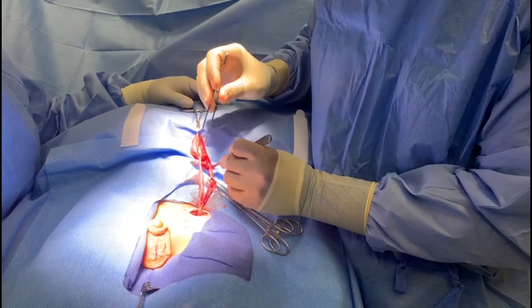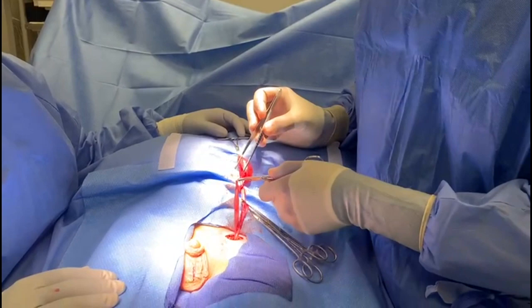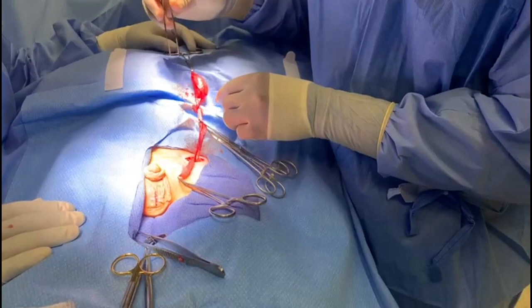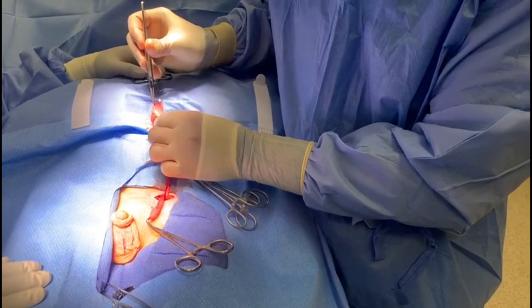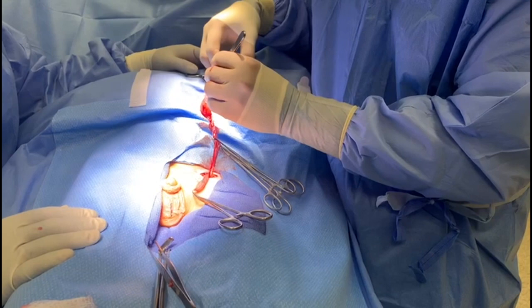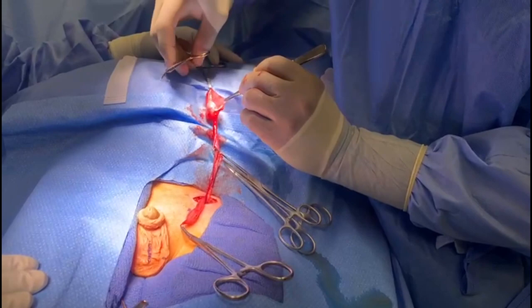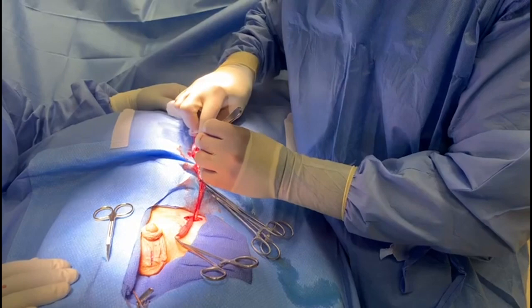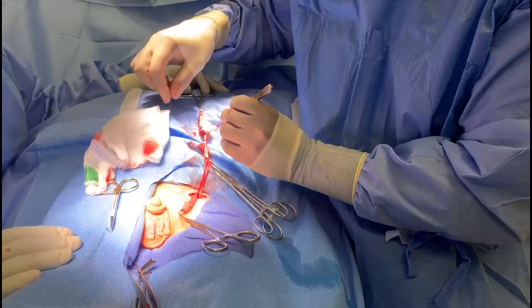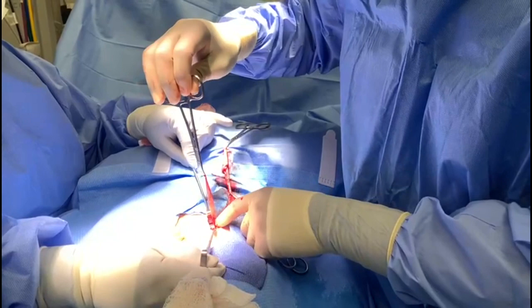We're going to open up the hydrocele and then fix the hernia by taking it down. We've disconnected the hernia — we'll take this all the way down to the external ring. Now we're just going to open up the hydrocele itself and free the testicle, then remove the tunica vaginalis. The testicle lives inside this hernia here, and there's really no connection between the two. The ostium between them was actually closed, which is why we got the loculated appearance.